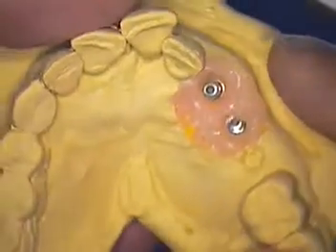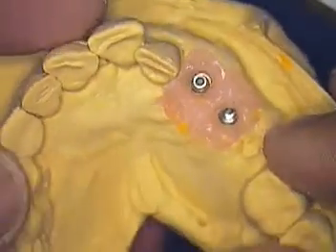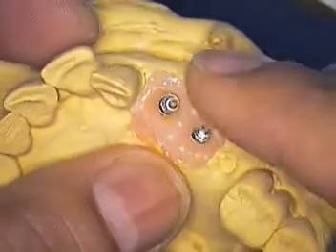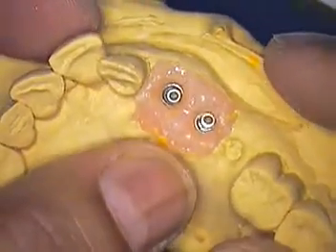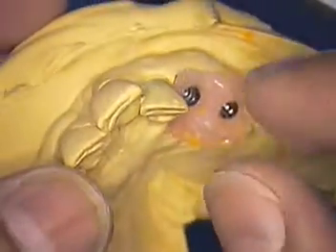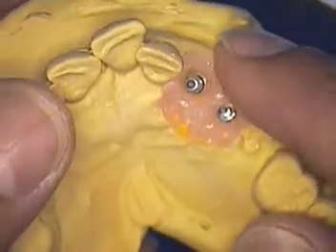The first step now after mounting the case is to go ahead and do a diagnostic wax up — make sure that we have the teeth in the right position. We can somewhat modify our original diagnostic wax up now that we know exactly where the implants are, and when we go to try in our implants, hopefully we'll be able to show you that on the next clip.